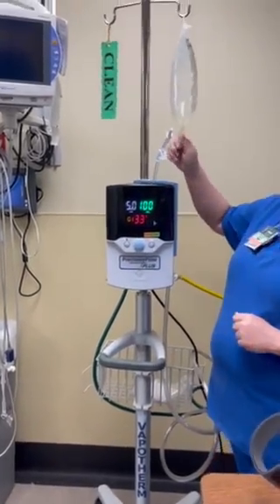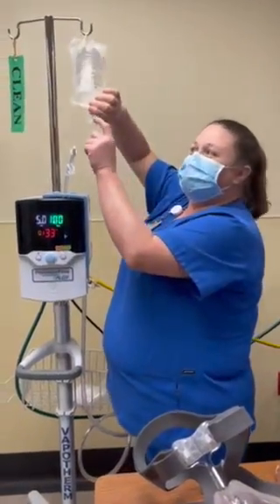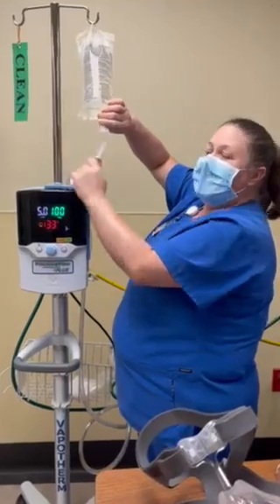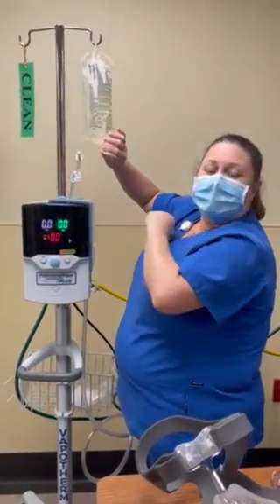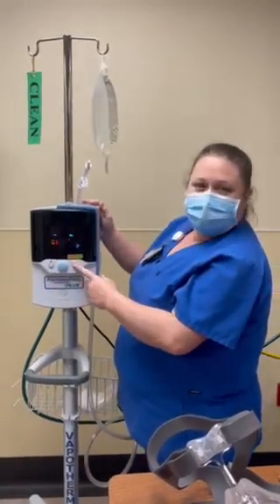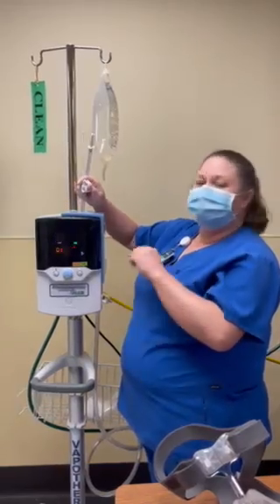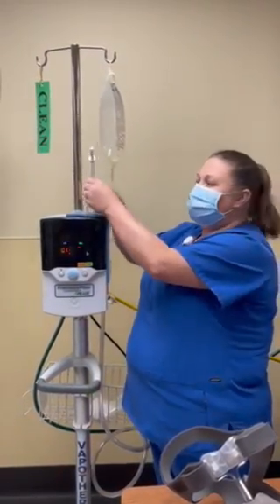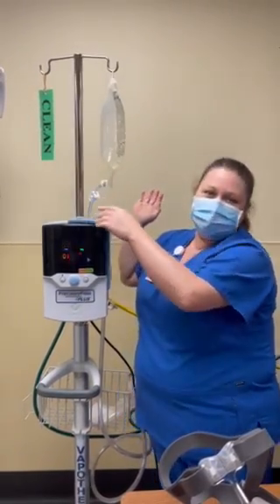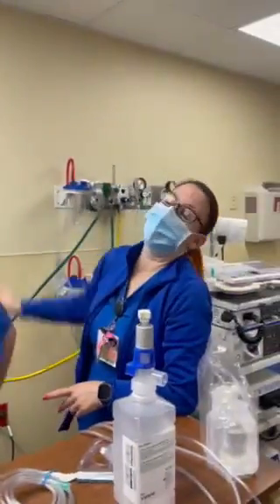If you need to change the water, if we have another bag hanging, you're going to take off this bottom piece, twist it off and spike the bag. Now if you put the Vapotherm on standby, you're going to hold this button to turn it on and off. But make sure that once it's off, you are clamping this so water is not just continuously running through the Vapotherm. Just remember to unclamp it whenever you turn it back on.